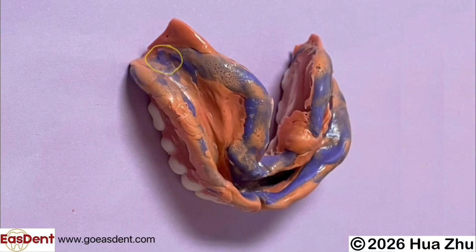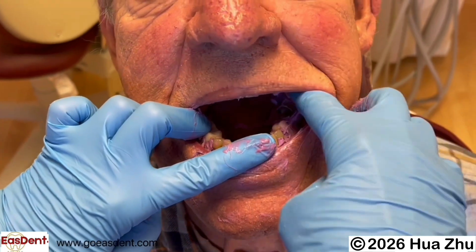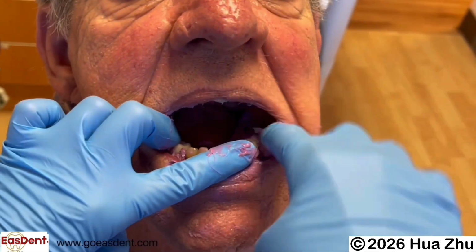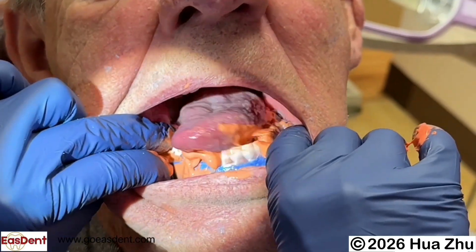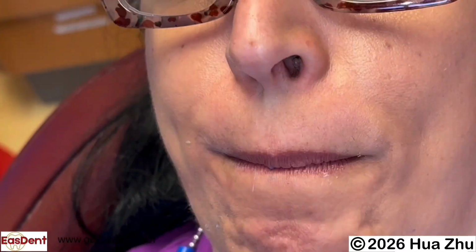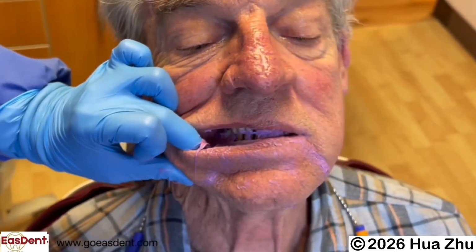It is easy to miss retromolar pads and distal lingual vestibular areas for mandibular arches. You can load extra material there. After loading extra material, press the material against the buccal and lingual vestibule area and retromolar pad area. Then mold the border with different lip or tongue movements and remove the extra material.